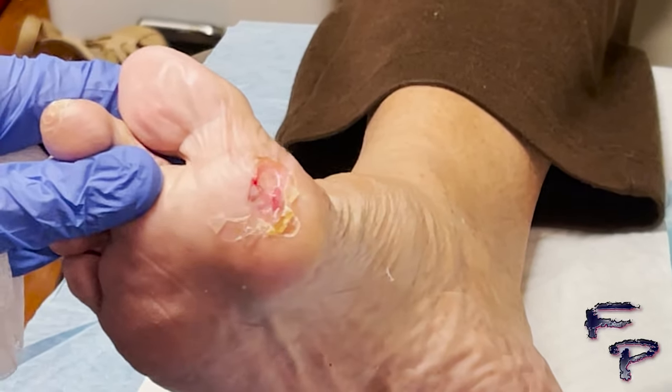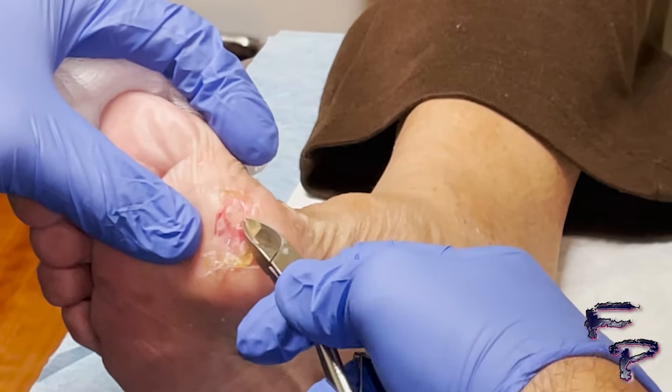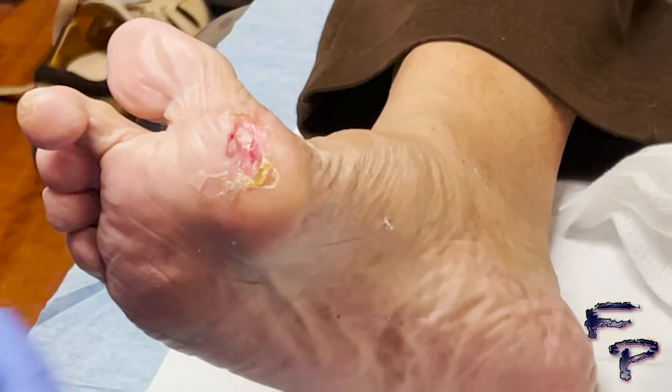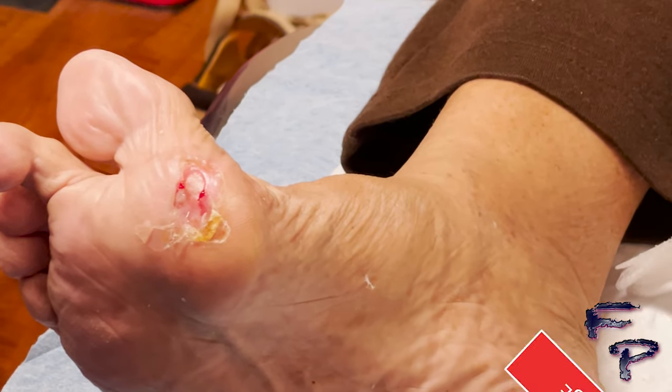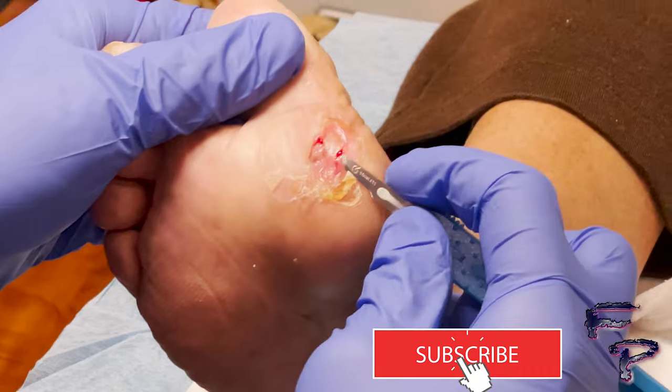Sometimes you can feel loose tissue as you go around, which is also debrided. There is an area of hyperkeratotic tissue noted on the plantar medial aspect of the wound.